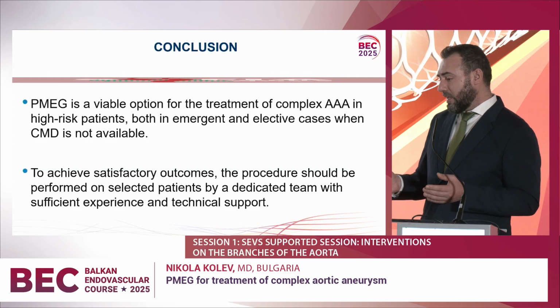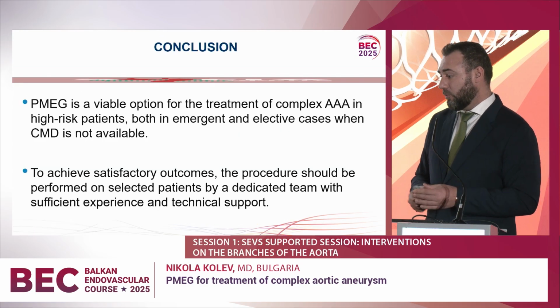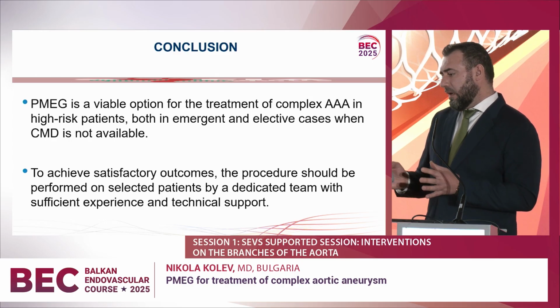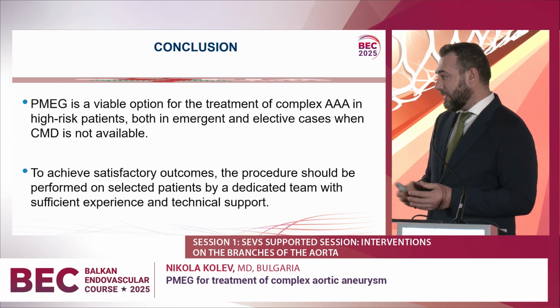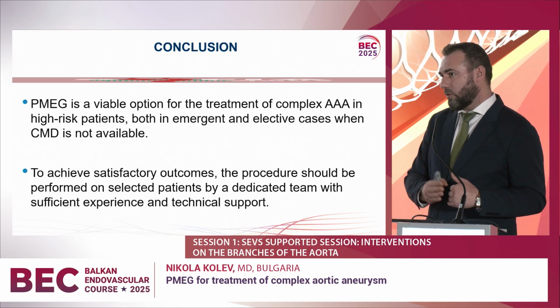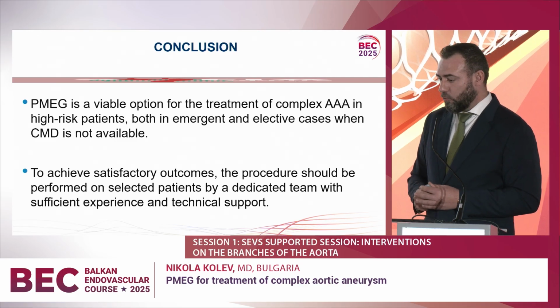So, in conclusion, physician-modified endografts are viable options of treatment of the complex abdominal aortic aneurysm in high-risk patients, in emergent or elective cases when the custom-made devices are not available or we don't have time to wait for a custom-made device to be produced.